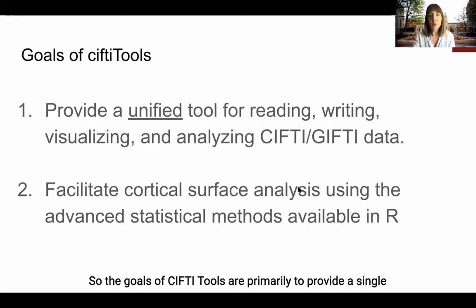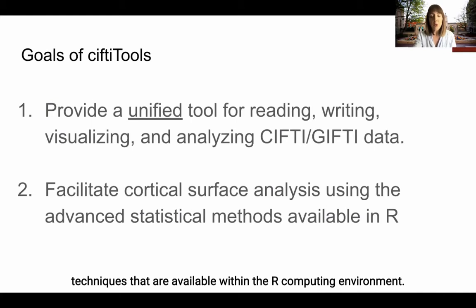So the goals of CIFTI-Tools are primarily to provide a single unified tool for reading, writing, visualizing, and analyzing CIFTI and its compatible GIFTI data in one place. And secondly, to facilitate the analysis of cortical surface as well as subcortical data using the advanced statistical techniques that are available within the R computing environment.